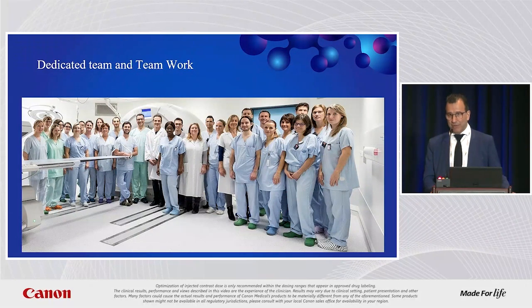We cannot do it every day because, as you have seen, we have blocked 2 teams, 1 surgical team, 1 interventional room, for 4 to 5 hours. But I try to do it in one session if I can. If it's dangerous for some tumor, if I cannot hydrodissect, I do a part first and I take the patient a second time, a few months later.